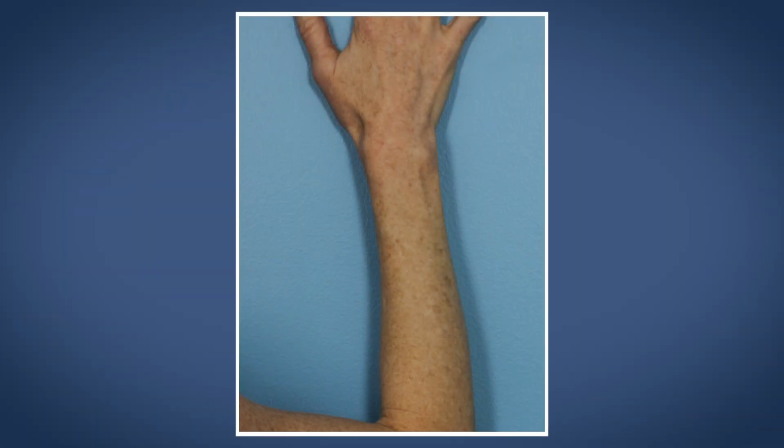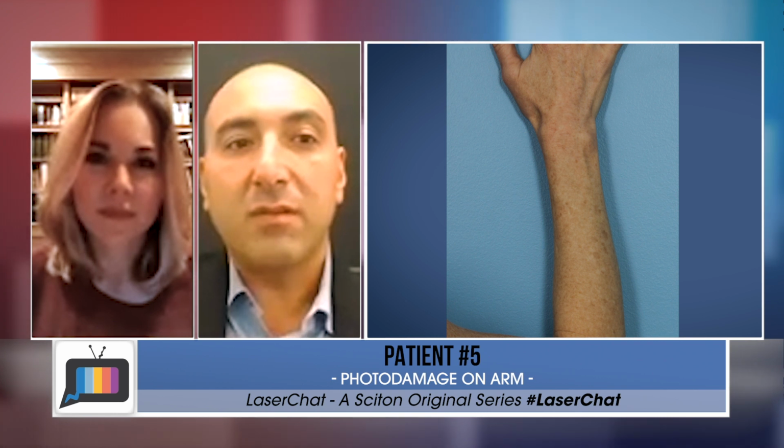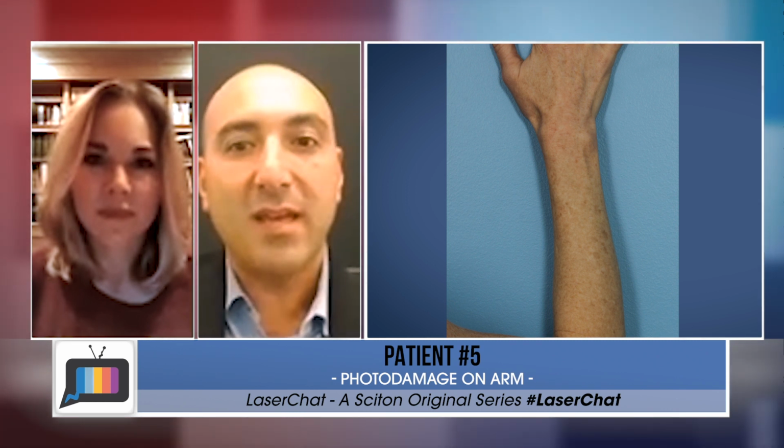These patients are tricky because I think there are 2 components going on here. You definitely have solar lentigines and that sort of background pigment, but there are also some macular seborrheic keratoses. They're kind of in the middle on the ulnar side of her forearm, and those can be really tough. And those are the ones that catch the patient's eyes more than the background faint brown. So, certainly BBL is going to be combined with whatever modality you choose to use beyond that.